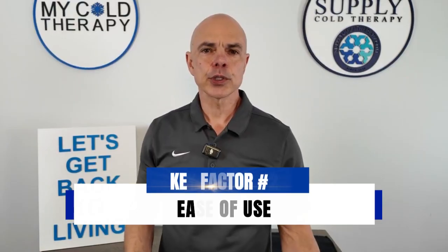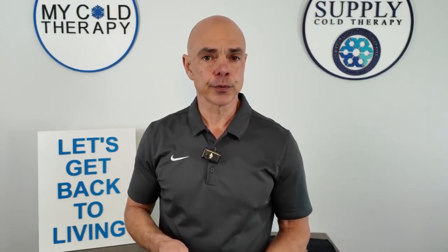Key factor number 2 is ease of use. So SMI states when you get the gel packs, what you need to do is put them in the freezer for 4 hours so that you'll get a full, they call it a full charge, and then you'll get the best performance out of these. They also say once the cold is gone that you have to put them in the freezer for 4 hours.